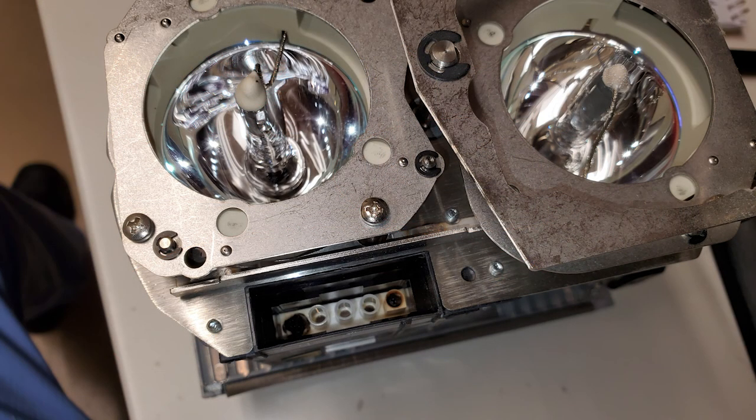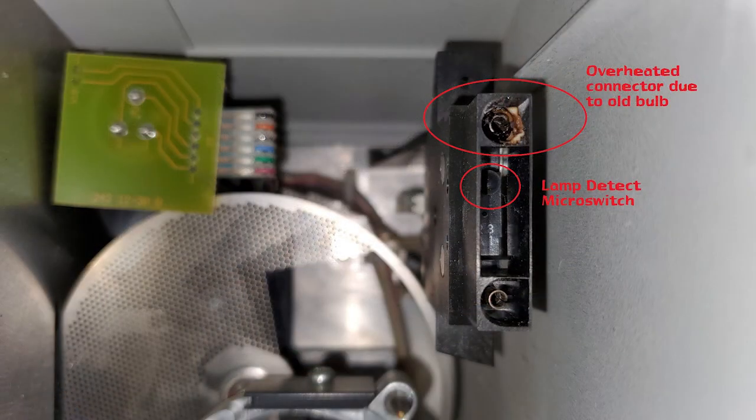This is what the lamp assembly looked like before I removed the bulb, and this is what the mating connector inside the microscope looked like before we cleaned it out and adjusted the pins. You can also notice the lamp detect micro switch — if the bulb won't slide in all the way and contact that switch, it won't turn on the light. These are just some of the problems that took this microscope out of service, all because of poor maintenance, poor cleaning, and neglect.